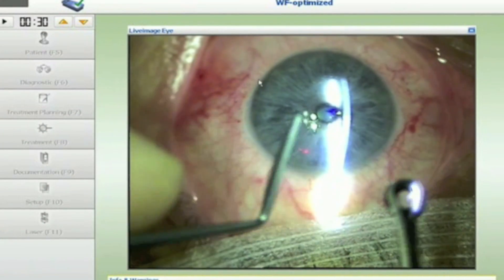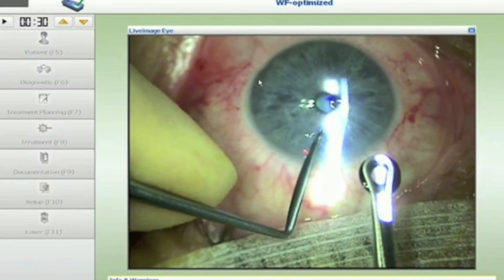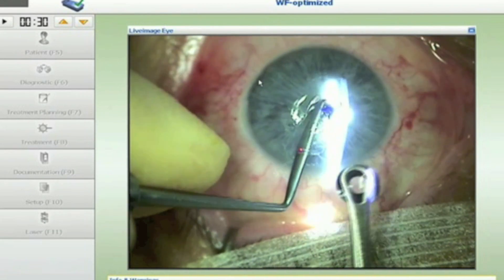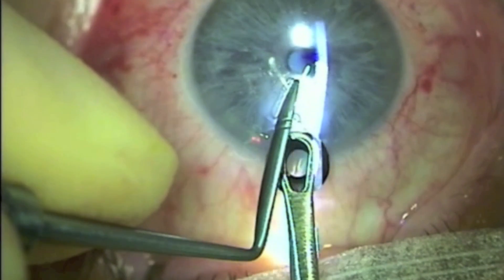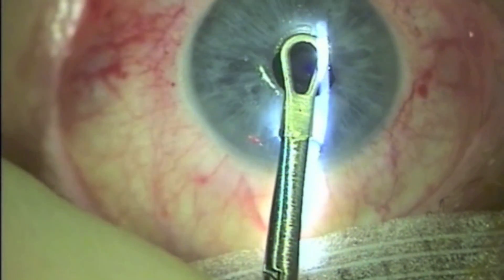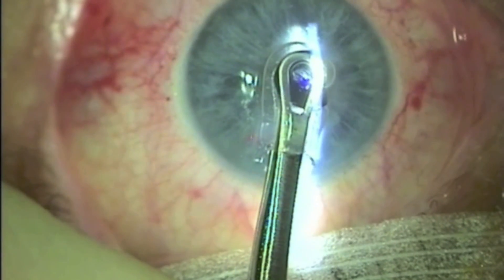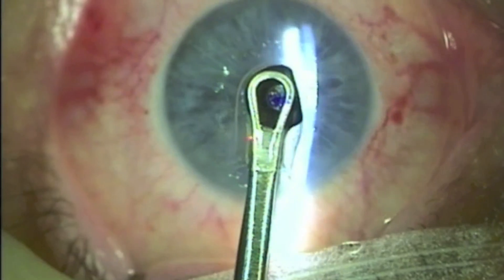The inlay is now grasped in the forcep and for pocket surgery the inlay is mostly covered by the forceps. An instrument is used in the left hand in order to gain access to the pocket, and the inlay is placed under this instrument and glided into the pocket. In this particular case we can see that the inlay is folded over on the nasal side and will have to be smoothed out later during the procedure.